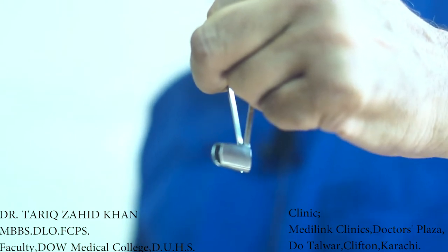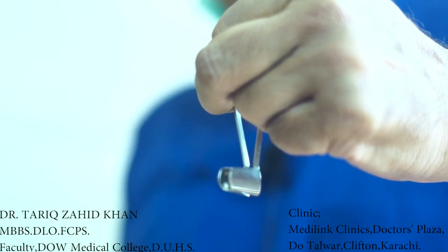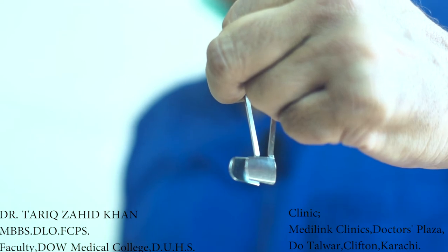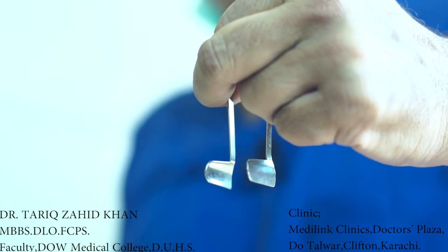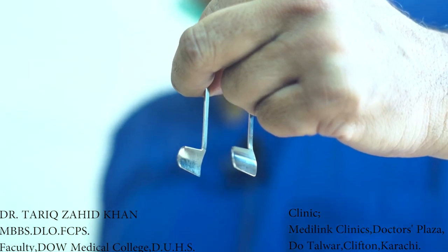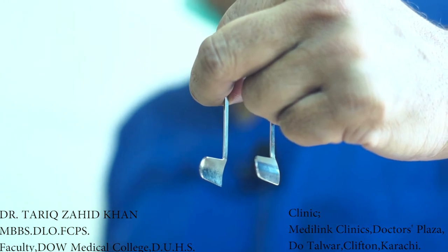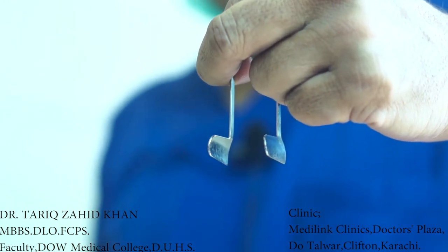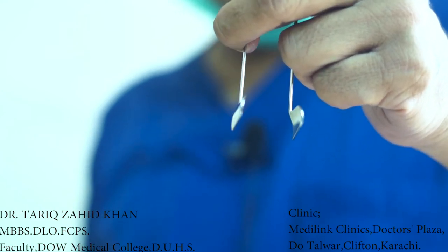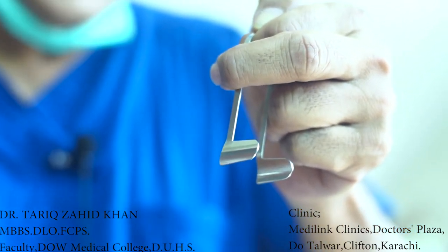We will insert this thordicum nasal speculum inside the nose of the patient. After entering into the nose of the patient, we will release pressure of our two fingers — ring finger and middle finger — so that the thordicum nasal speculum will open up. When it opens up, the nostril or nasal cavity of the patient will be retracted, and you will look into the nasal cavity with great ease. All the structures of the nasal cavity would be appreciated in good detail.